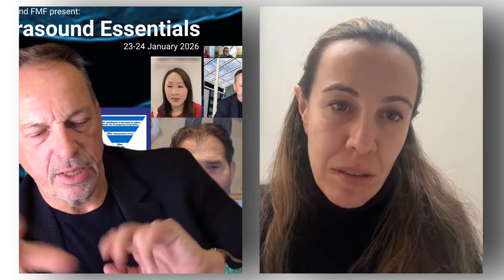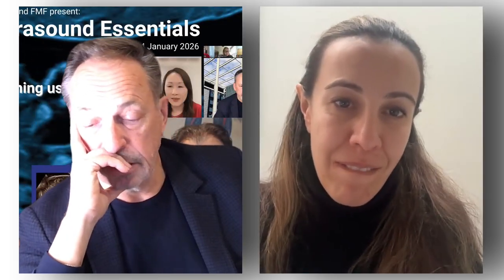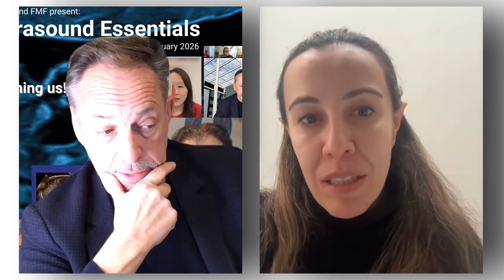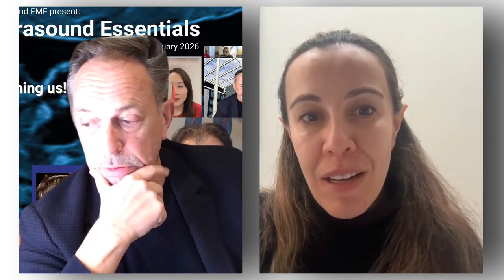In cancer, the omental appearance is a little bit different. You kind of get an omental cake in cancer. It's more layered, and this blanket thing you get with TB. But it can be difficult. I think blood flow is generally a bit less, as Regina's already said, in TB as well. It's not quite as hypervascular as you get in acute infection from other types, but also in cancer as well. But it can be difficult, and I think it's a clinical challenge even for people like Regina.